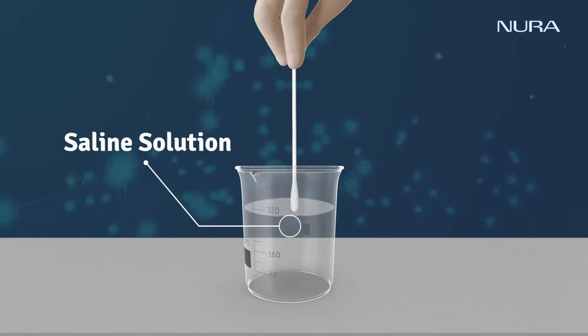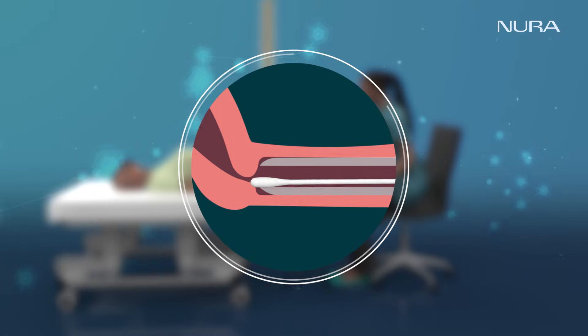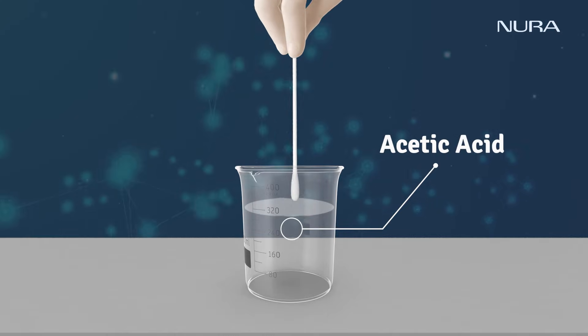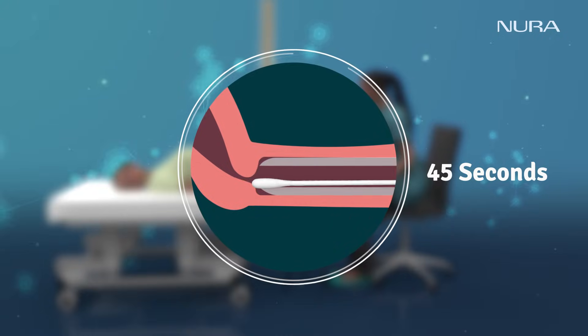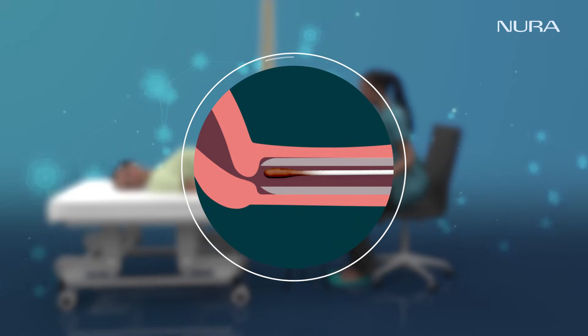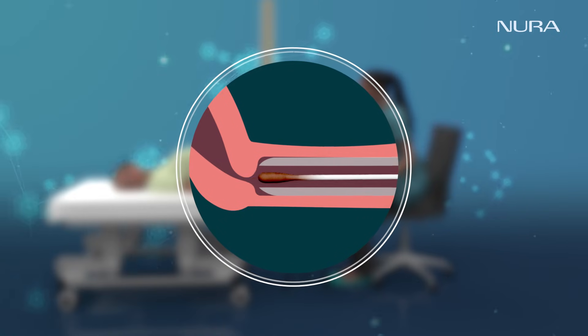A small amount of saline solution will be used to swab the cervix and take images. The examiner will then keep applying acetic acid for 45 seconds and take images. The cervix is then stained with Lugol's iodine, and images are taken.